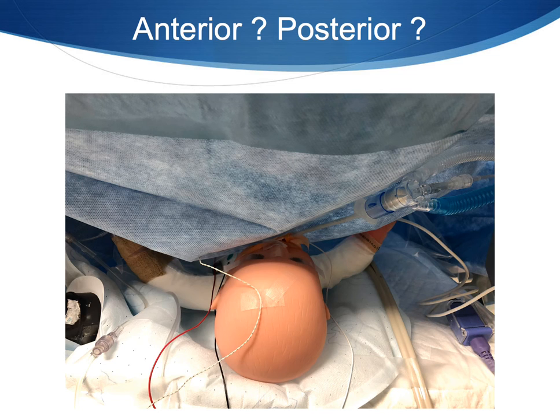Also, at the same time, you've got heavy drapes pushing down on that endotracheal tube. You may have a surgeon's arm pushing onto your airway also, or they may throw suction tubing or any kind of instruments up there, which is going to weigh that drape down and also affect that endotracheal tube.